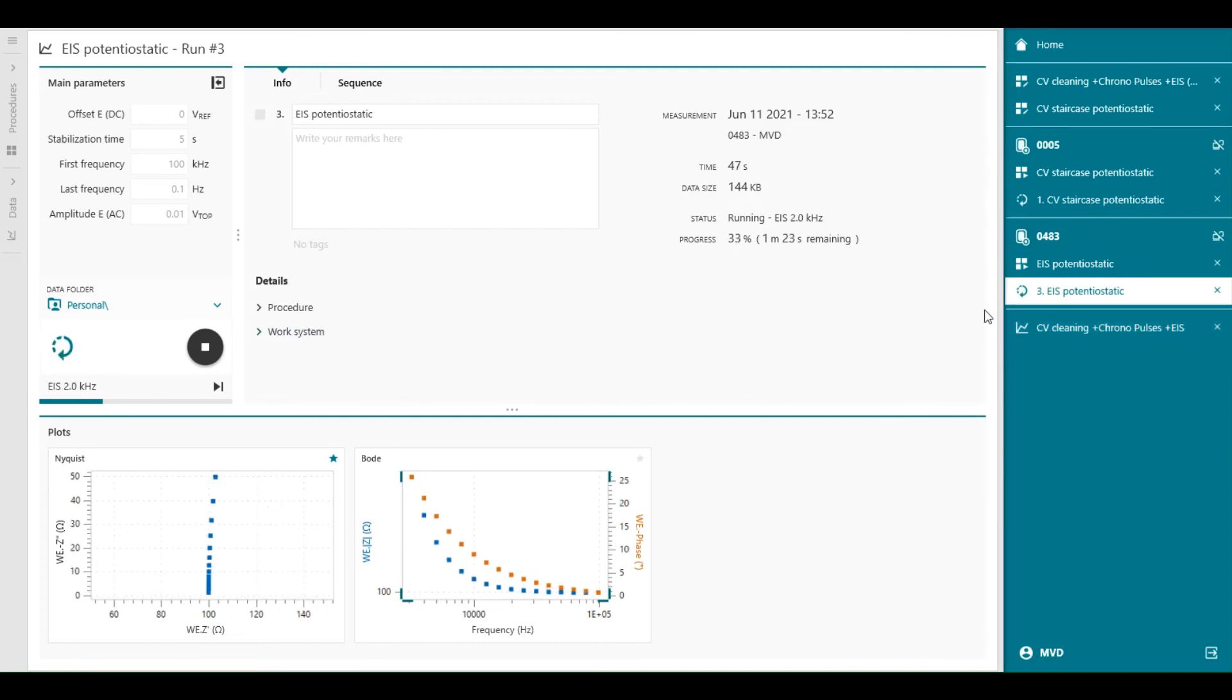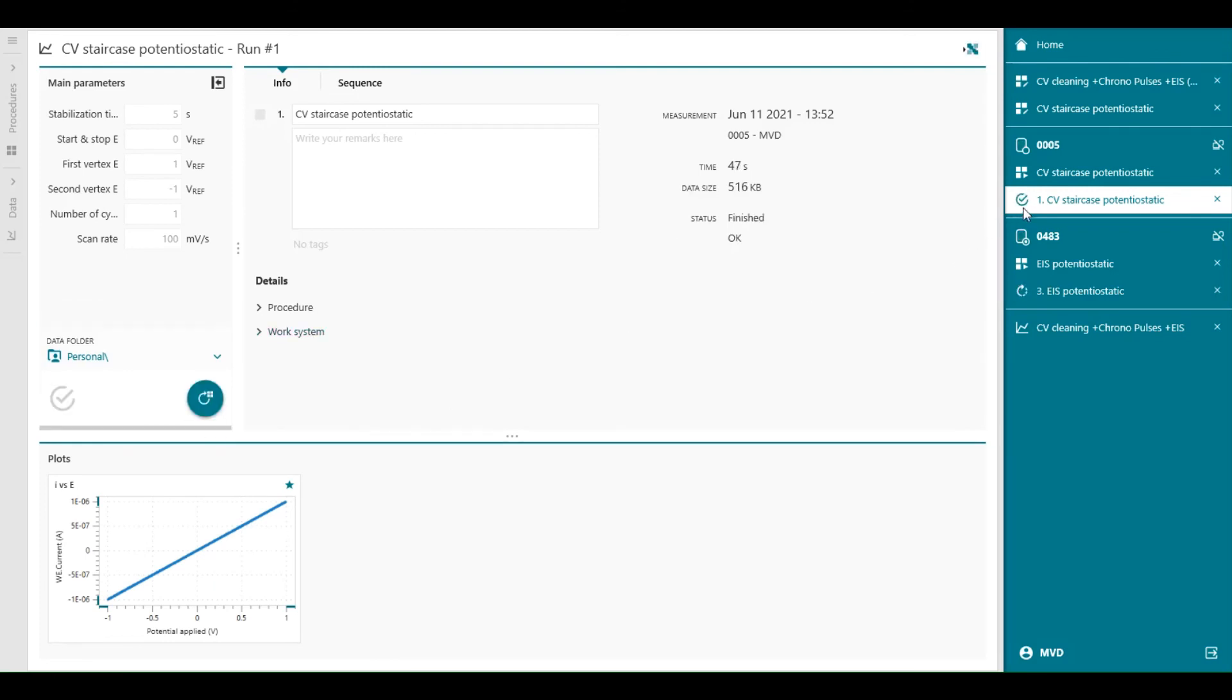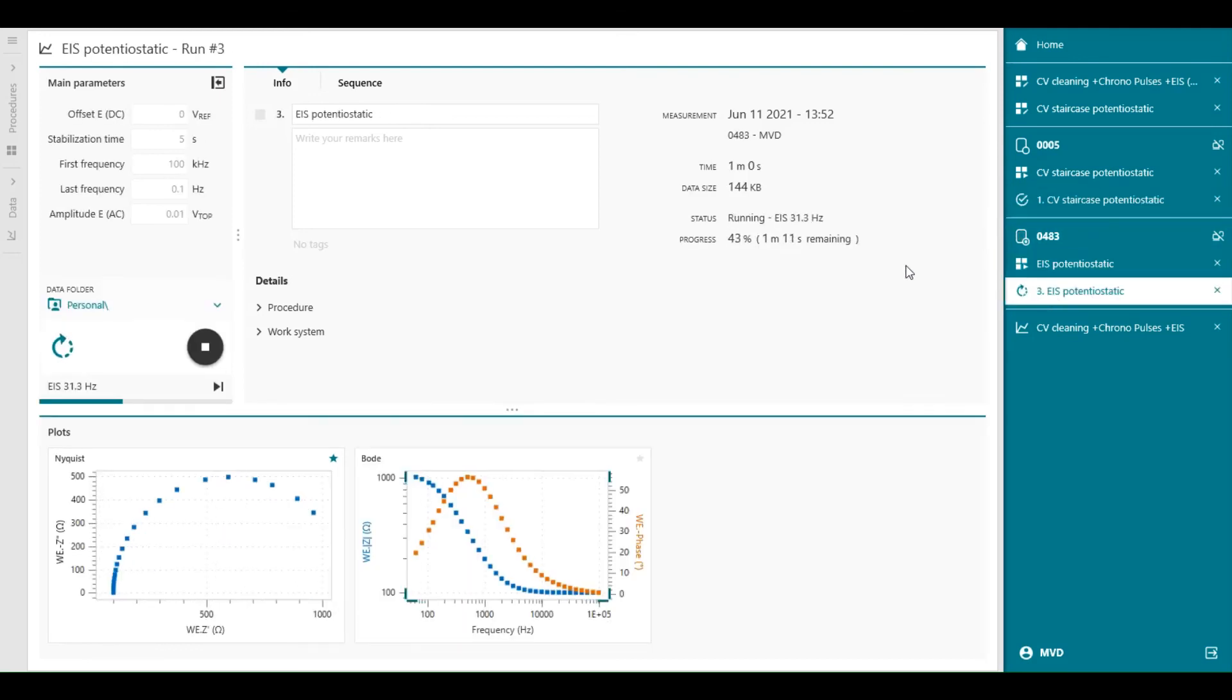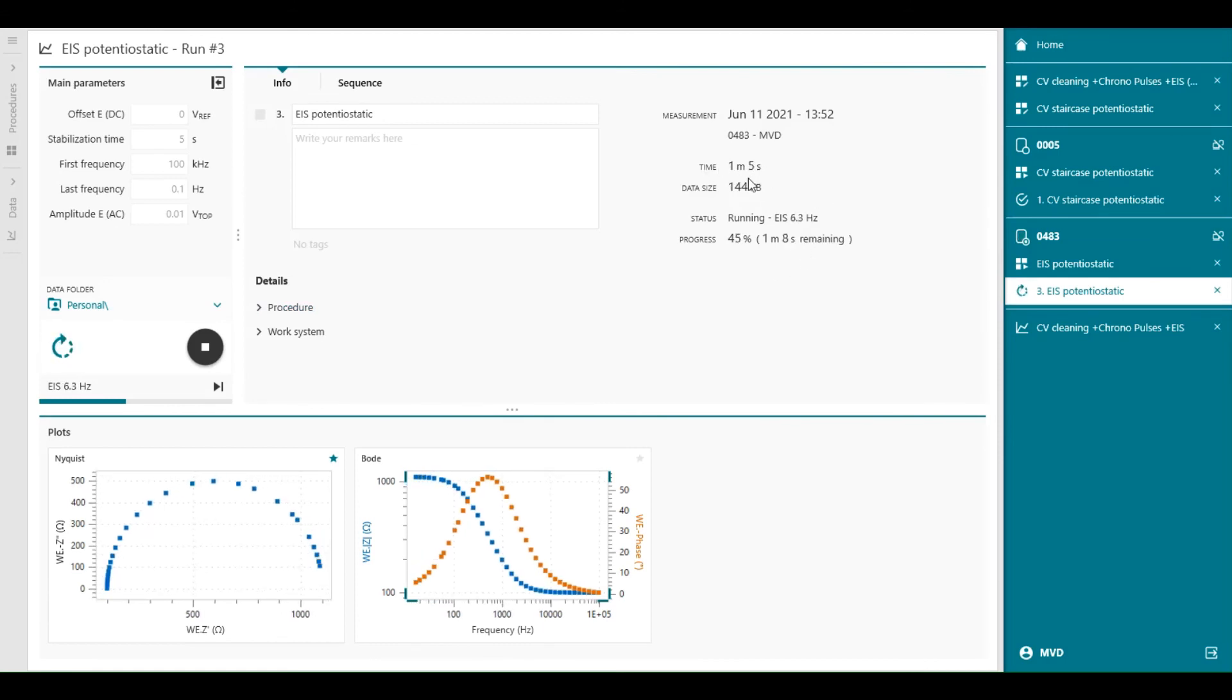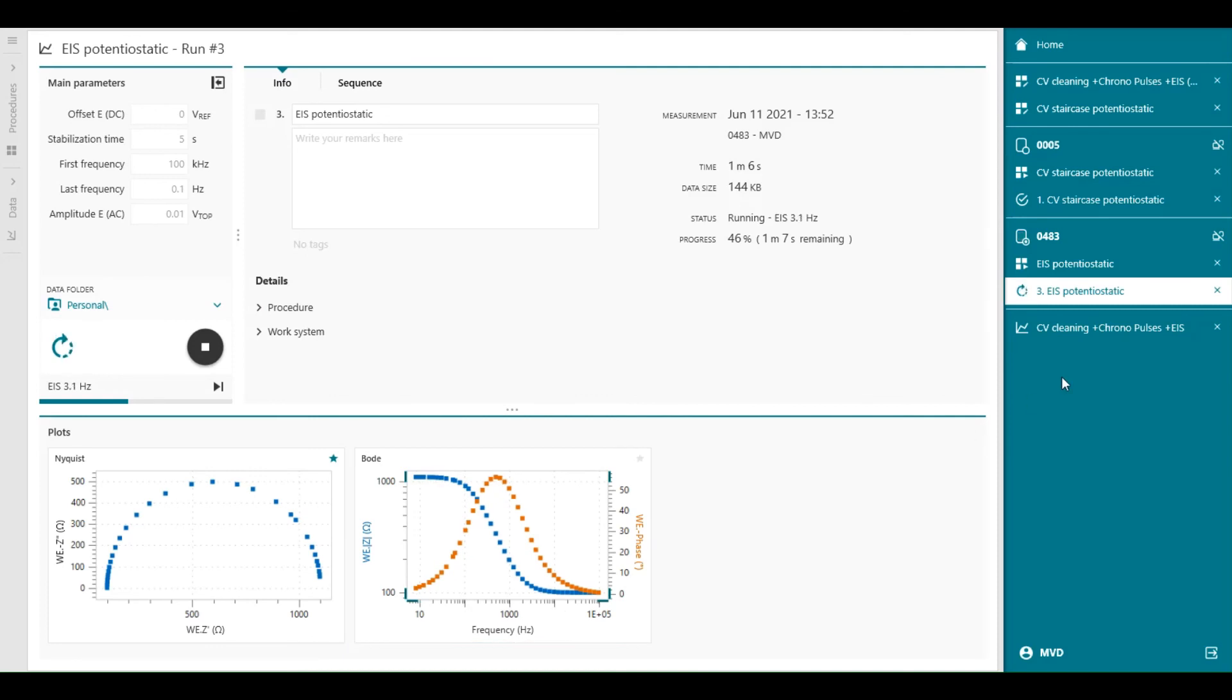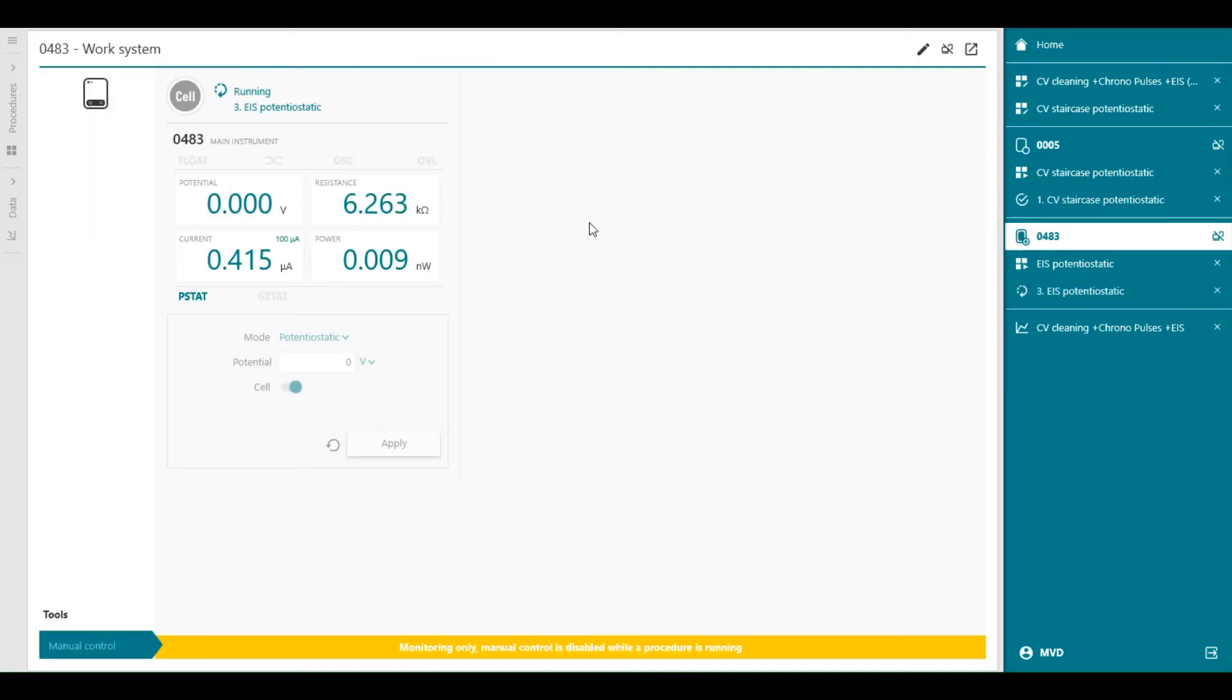So the measurement is running. This one is almost finished, and the moment it's finished, you see a check mark in the data run. This is still busy, so we can follow how many minutes we still have left. One minute.